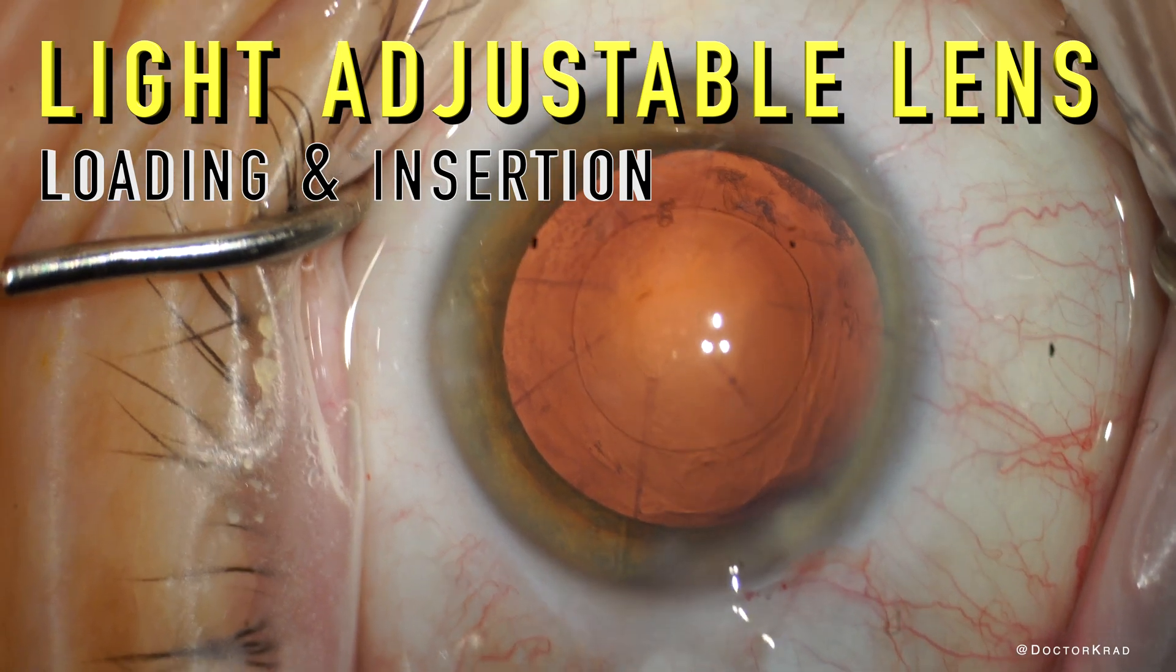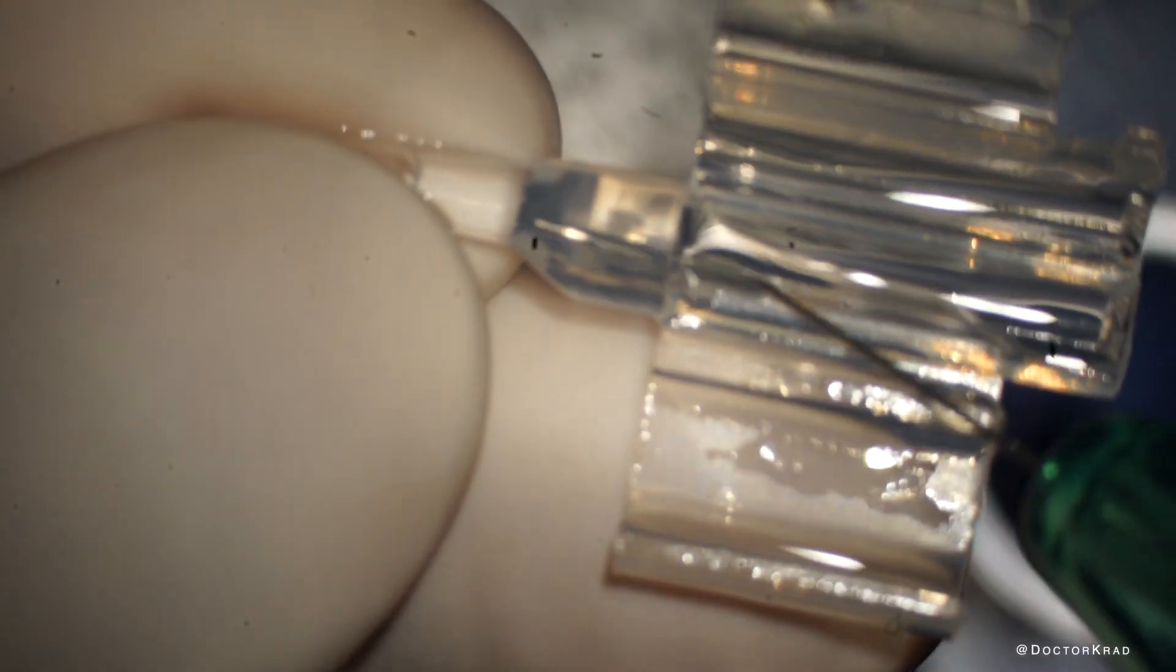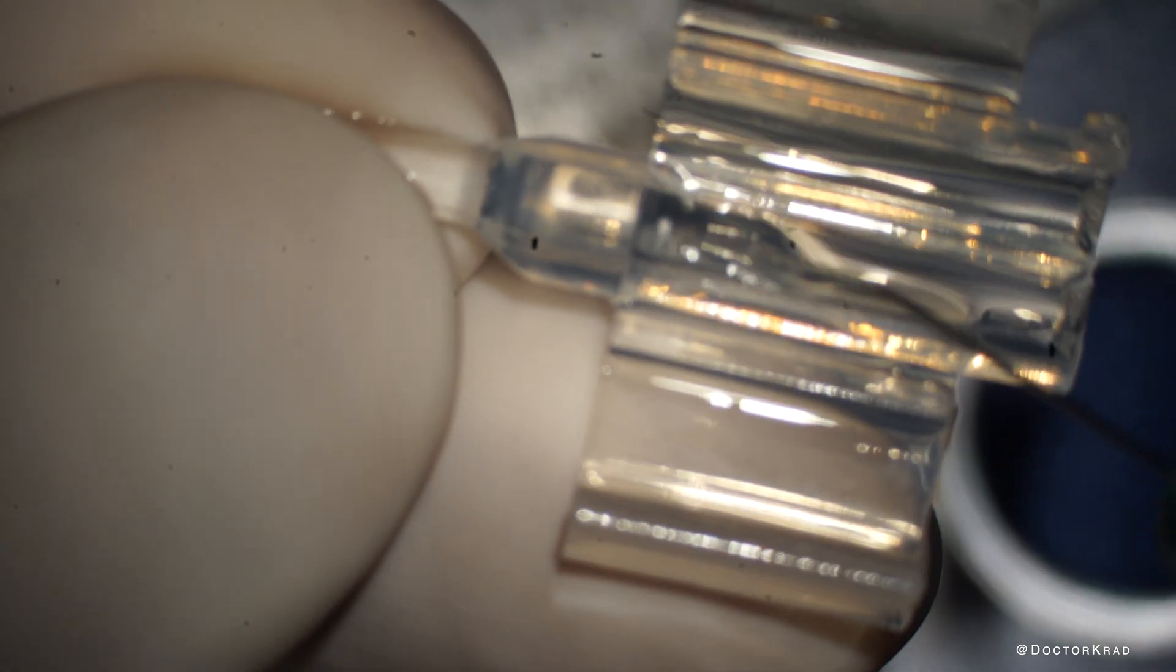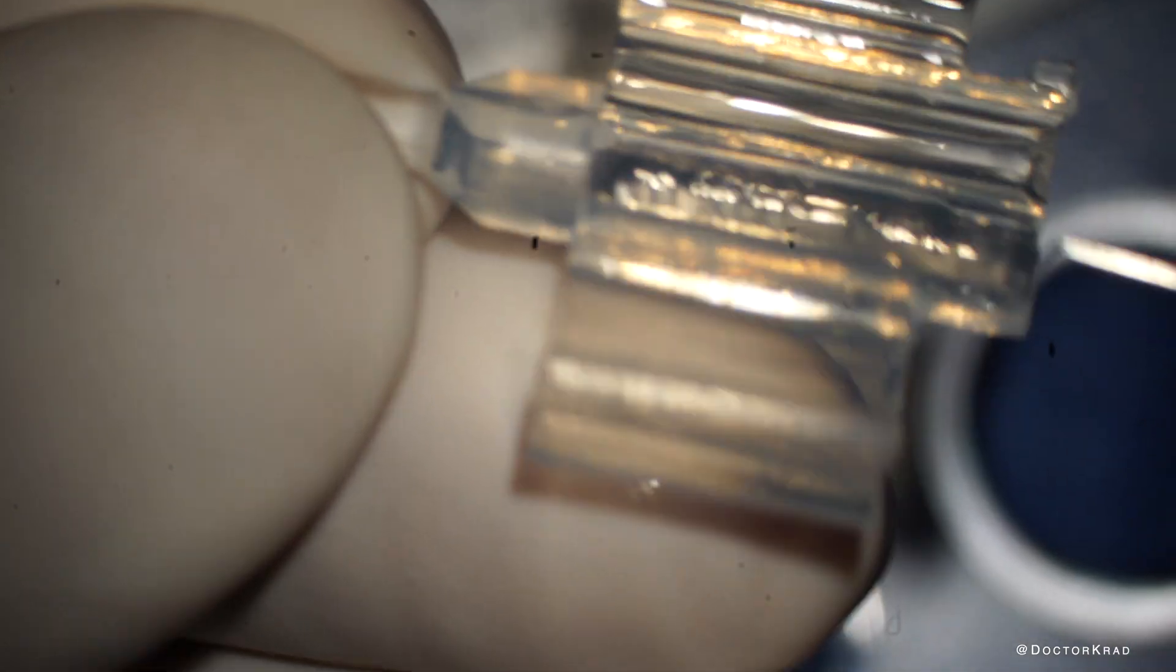Hi everyone. Today I'm going to show you how to load the light adjustable lens. So first you fill the nozzle with viscoelastic as well as the base of the cartridge.